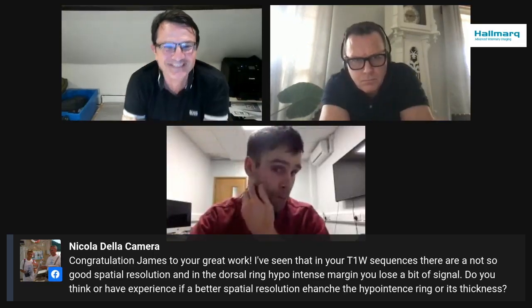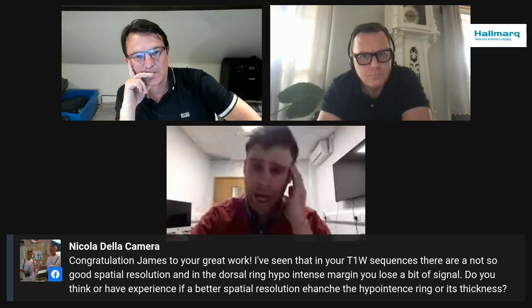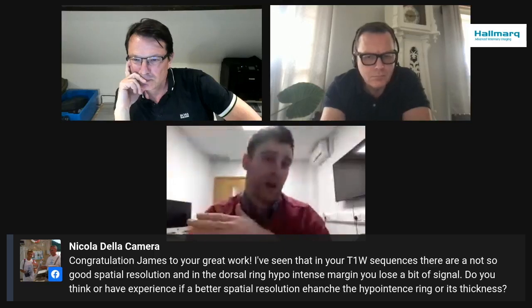Yeah, I mean, on the T1 sequences, we're very lucky here. In most of the studies that we looked at, we did a volumetric acquisition, so we could look at it in all planes. Which meant that even though the ring was thin, we had the privilege that, if there was partial volume averaging that might make the peripheral region look incomplete, we could appreciate it in all three planes, and then we could conclude that actually it was fine. So I haven't got a definitive answer, but that was how we overcame that problem in most circumstances.